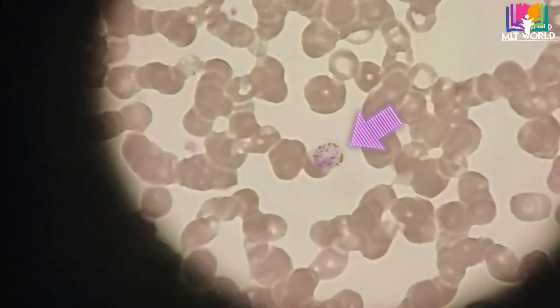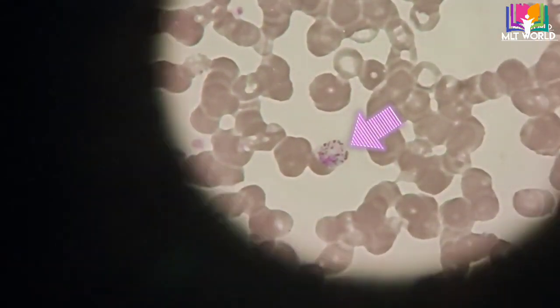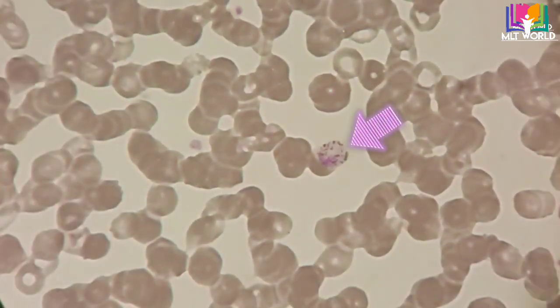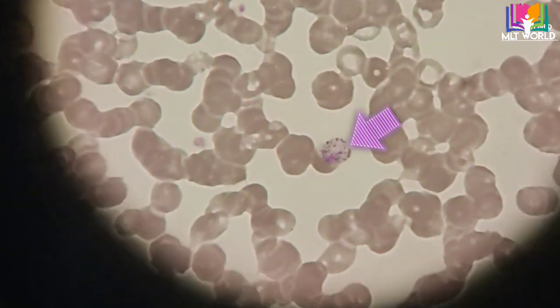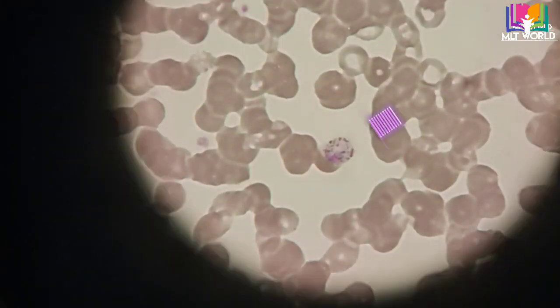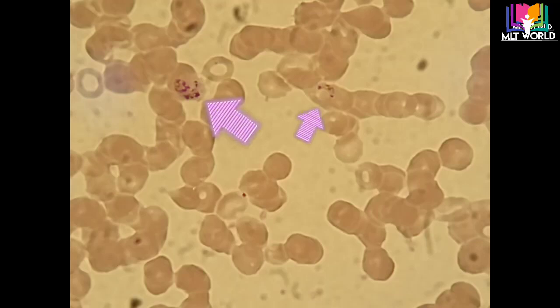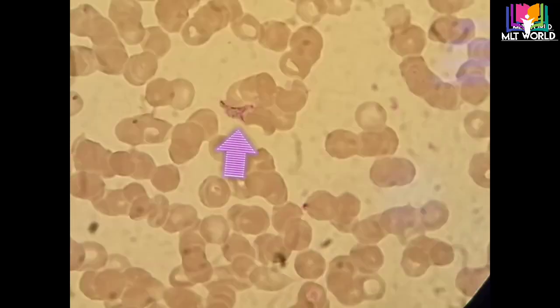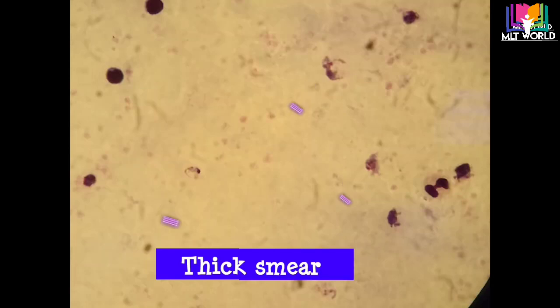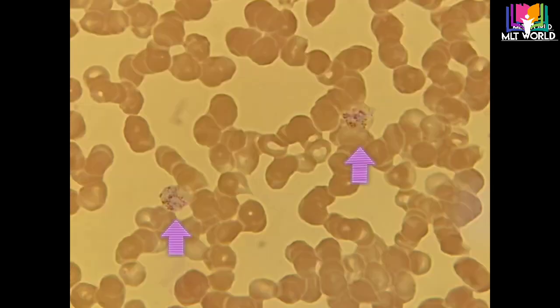The basic purposes of making a blood smear are two: first, to read the blood film and find any abnormality in white blood cells, red blood cells, and platelets; second, to find out parasitic infections — either malarial parasite or any other parasite that infects the blood. You can use other stains, but for malarial parasite detection and for the blood film, Giemsa stain is the best. If you don't have Giemsa stain you can use another stain, but for malarial parasite study you must use Giemsa stain.